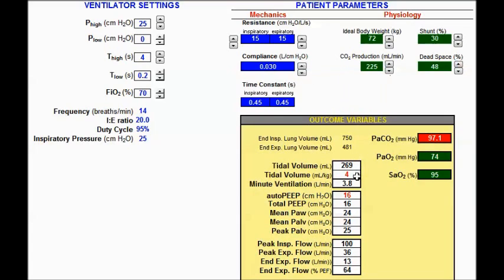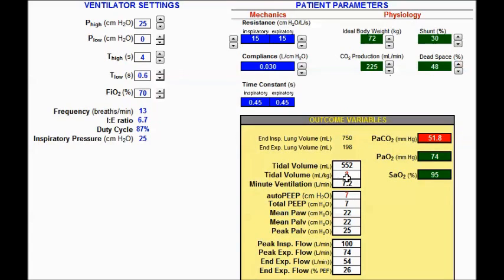With compliance at 30 and t-low at 0.2: tidal volume is safe but there is quite a bit of auto-PEEP. Changing to 0.4: tidal volume is a little higher, still in safe range at 6 cc/kg, auto-PEEP is less. At 0.6: tidal volume is not as safe, auto-PEEP is less. At 0.8: tidal volume is now not in a safe range.